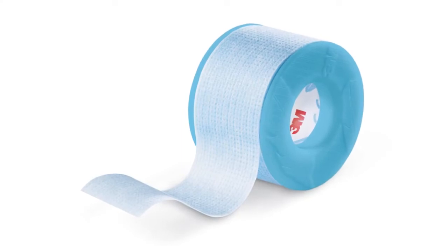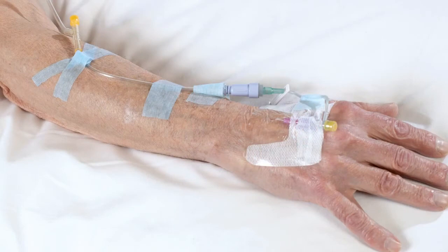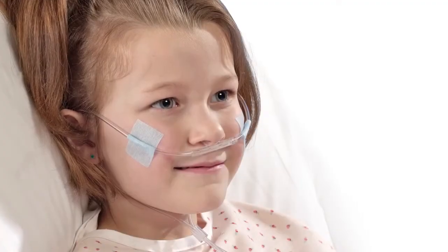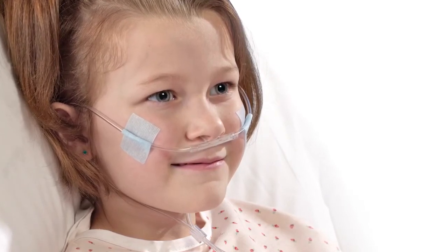Silicone-based tapes use a different class of polymer as compared to acrylate adhesives. Because of this, they behave differently on skin. Tapes, such as the 3M Kind Removal tape, are unique in that they have high adhesion but remove gently from the skin. They can be an excellent choice for securing lightweight dressings on at-risk skin, including newborn and geriatric patients. Additionally, because of the unique chemistry of the adhesive, it can be removed and reapplied without losing significant ability to adhere to the skin. Because of its gentle release, silicone-based tapes are a great solution when repeated application is necessary.